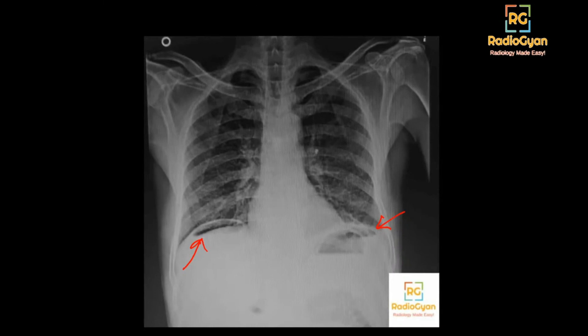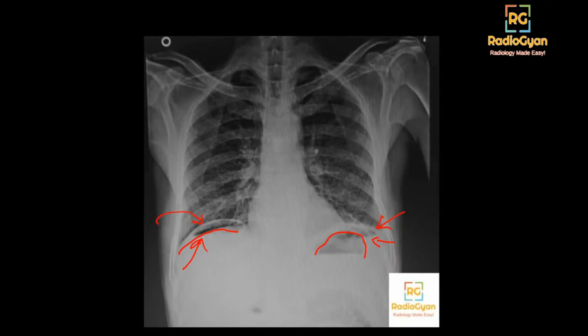For those who had difficulty identifying the gas under the left diaphragm, this is the stomach bubble and this air should not be here. This is probably the liver margin, and what we see here is gas under the right dome of the diaphragm. A common pathology can masquerade this — so what if you see only air under the right dome of the diaphragm and the patient is asymptomatic? What is that condition called?